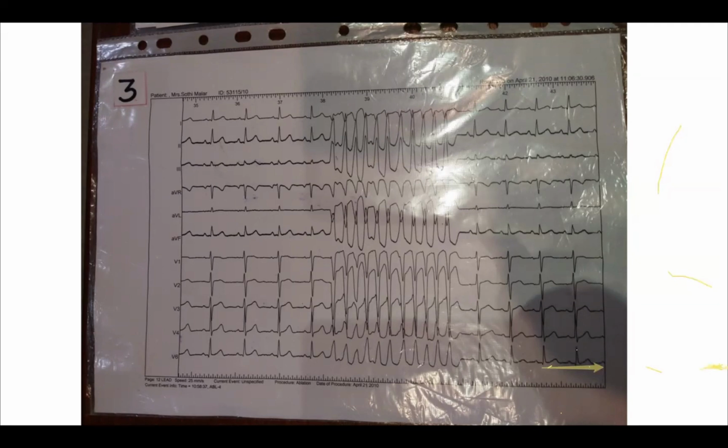And remember, a practical point: if a patient doesn't come out with the maximum shock, don't shock again and again if the patient has some blood pressure. You have to make some change. Either change the pad position or give some amiodarone and then try the shock, because then you are modulating the milieu, the environment inside.